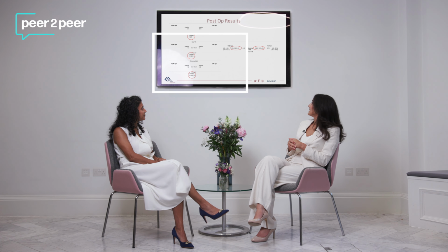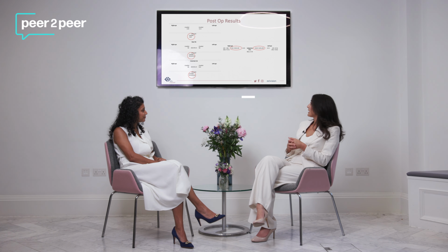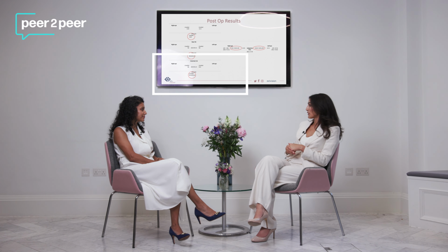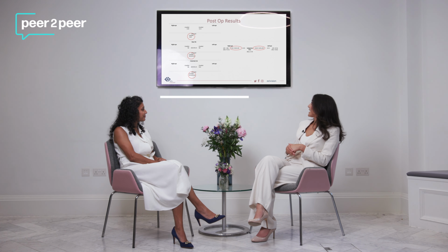So with the right eye, he ended up 6/18 unaided, which we would expect with a -1.5 refraction, but he had excellent near vision of N4 in the right eye, which he was very happy with, and N5 for intermediate binocularly, which was brilliant. In his left eye, which was targeted for plano with a RayOne monofocal lens, he achieved -0.12 or 6/5 vision in the left eye. And he had an excellent refractive outcome and visual outcome, and he was really happy with the results.